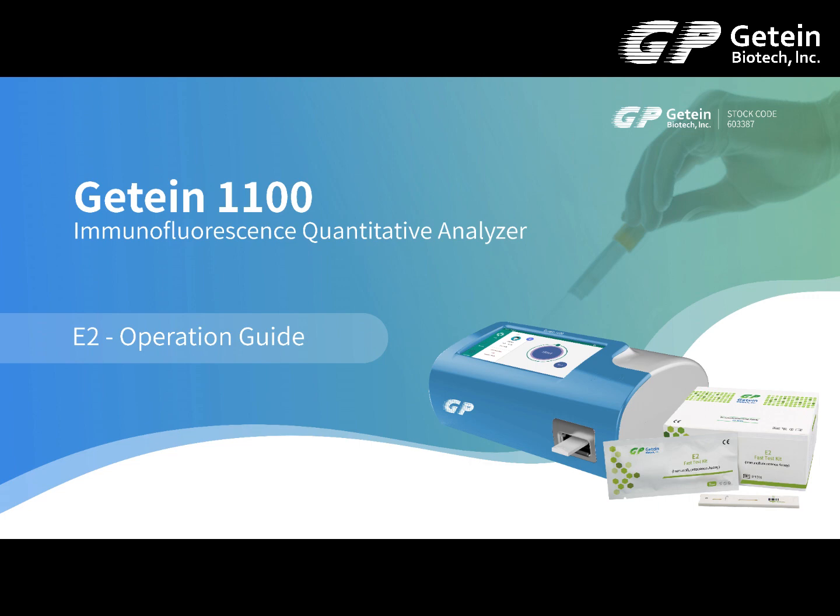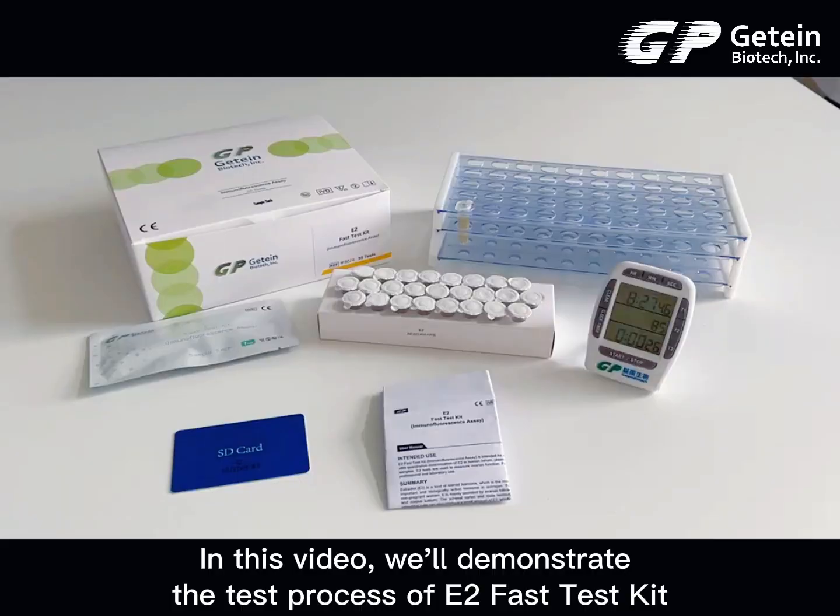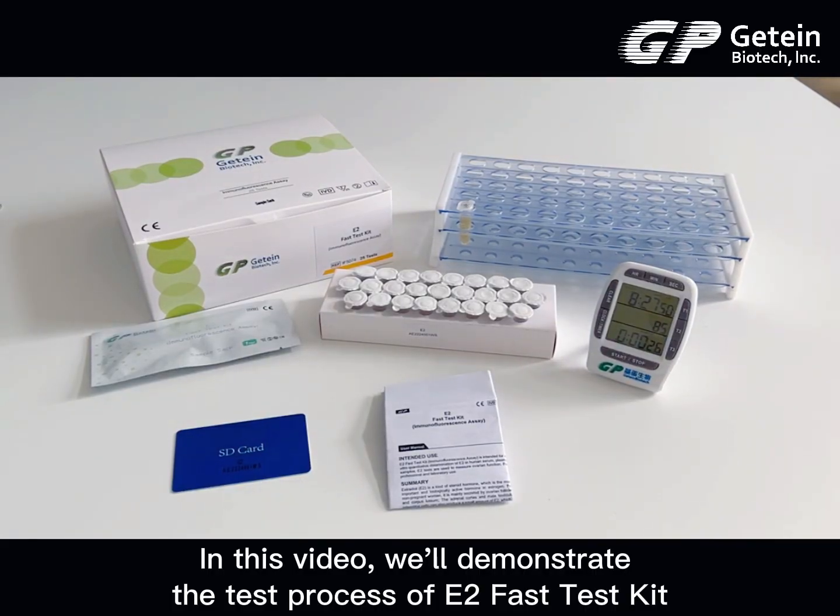Getein 1100 Immunofluorescence Quantitative Analyzer E2 Operation Guide. In this video, we'll demonstrate the test process of E2 Fast Test Kit.